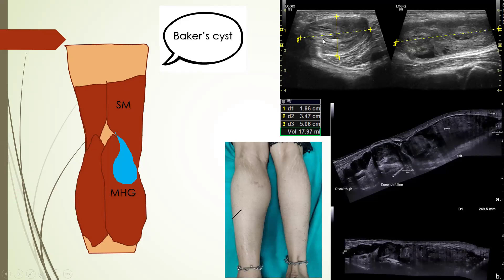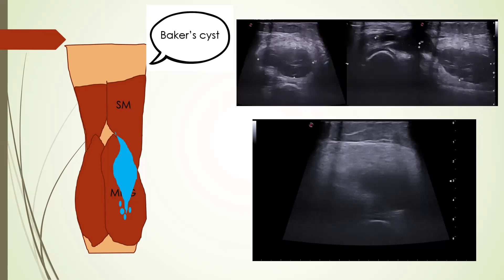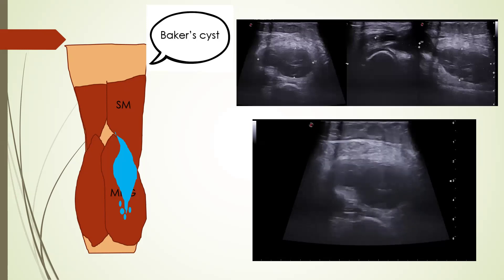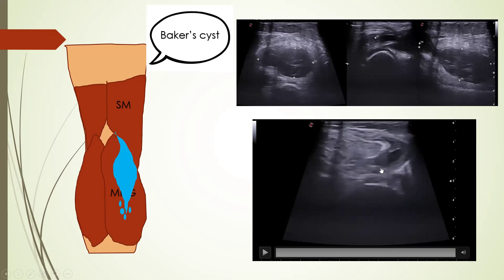Here we can see synovial thickening filling the Baker's cyst, and in this panoramic image it is extending from the distal thigh up to the mid-calf. We can also encounter rupture of a Baker's cyst, where the patient presents with severe calf pain and swelling. In this video the Baker's cyst has ruptured into the subcutaneous and intermuscular planes, which can clinically mimic deep venous thrombosis.